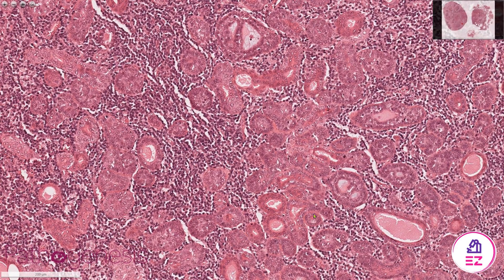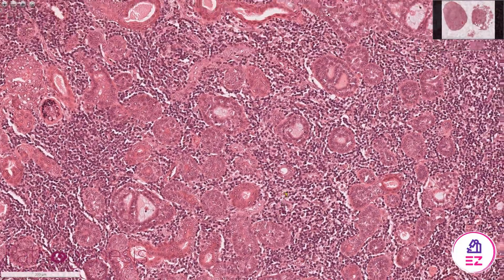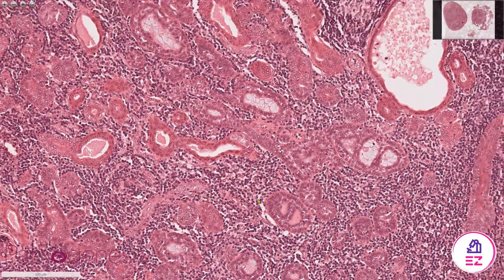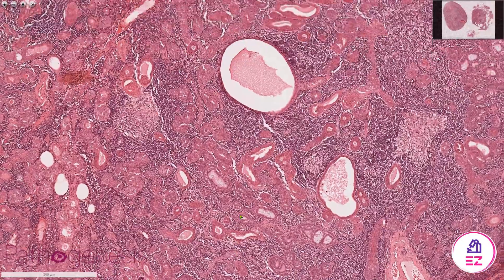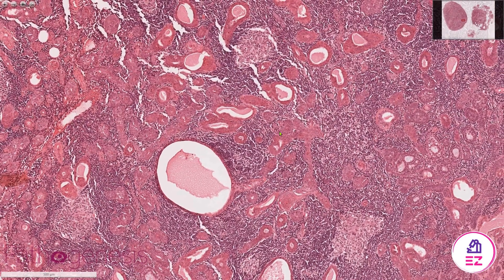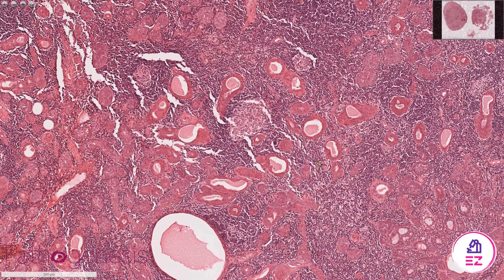I'm just going to show you another area here so you can see the variability in this particular field. We've got lots of ductal structures — as I said, the basal cells seem to be quite well formed, like in a basal cell adenoma — but perhaps here the sebaceous elements aren't as well formed, though as you saw earlier, they are present in places.